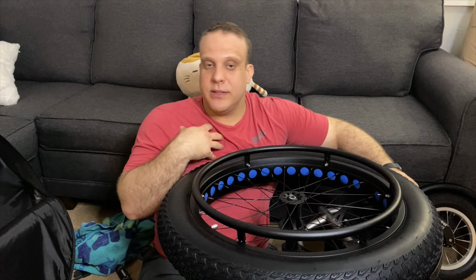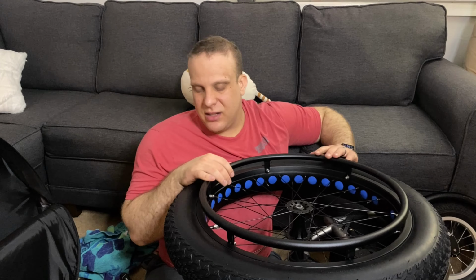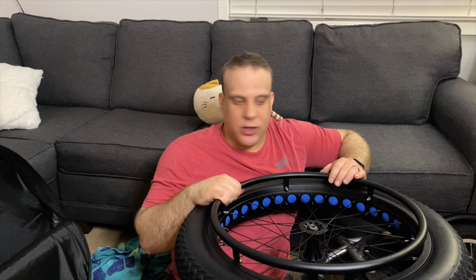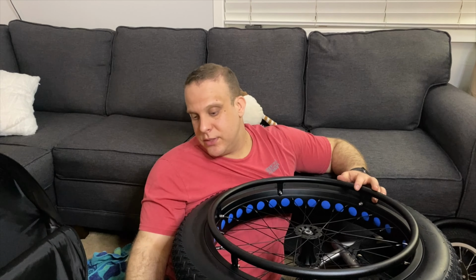Don't use, this is my personal opinion, there are probably a couple of different options out there, but don't use WD-40. It is a lubricant, but it's technically something to break down bound-up things. So in my opinion, you want to use something that's more of a grease. I don't have it here, but I use a white lithium grease that gives a coating, not a corrosive, to put on your axles to keep them loose and lubed. If you have something like I had, that bolt that was bound up, use a corrosive like WD-40, because that's breaking down rust and things like that. But you don't necessarily want to have that on your axles all the time.